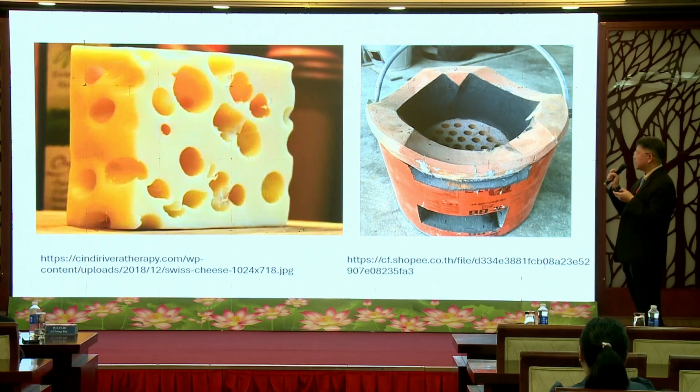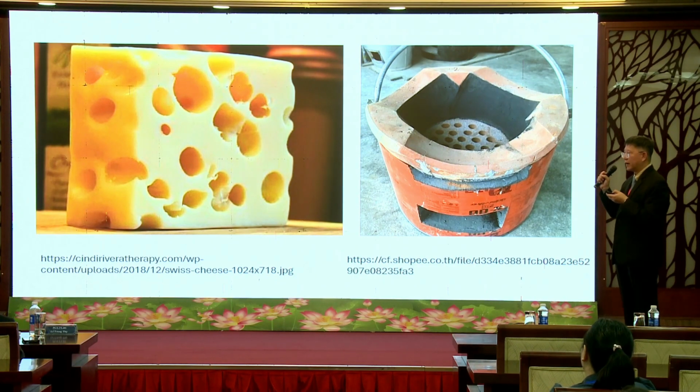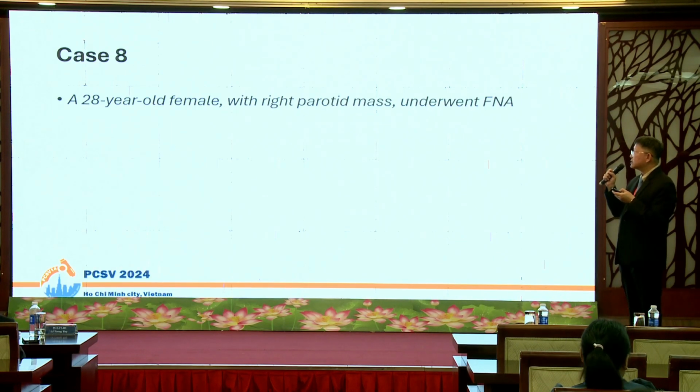Okay, so this is Swiss cheese and a charcoal stove, which again pathologists always compare with morphology. This Swiss cheese and charcoal stove is compared to the pattern of growth in adenoid cystic carcinoma, the cribriform pattern. Okay, now we go to the last case.